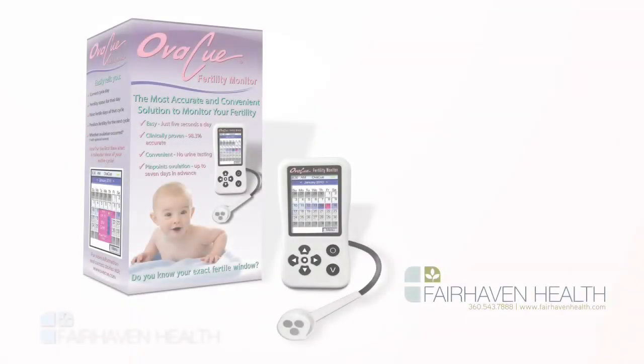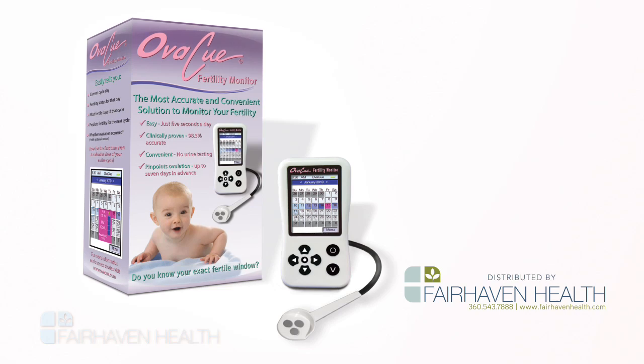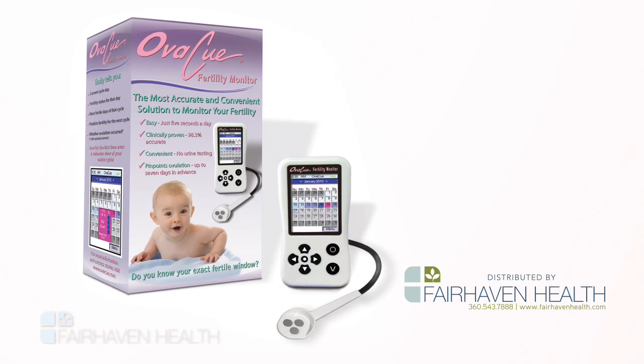The OvaCue Fertility Monitor represents the latest innovation in ovulation testing, using your saliva to predict your ovulation date up to seven days in advance.